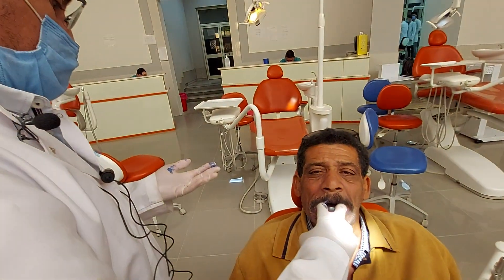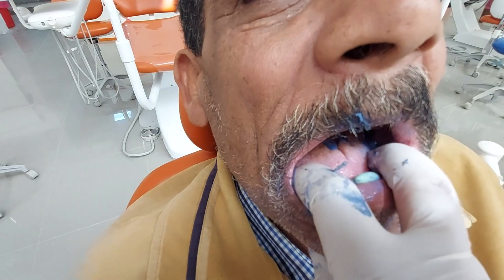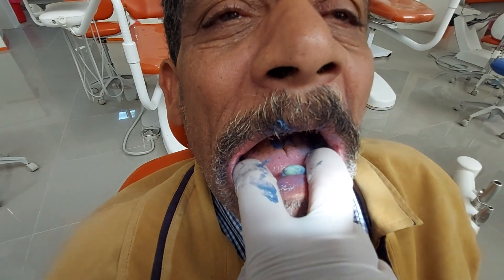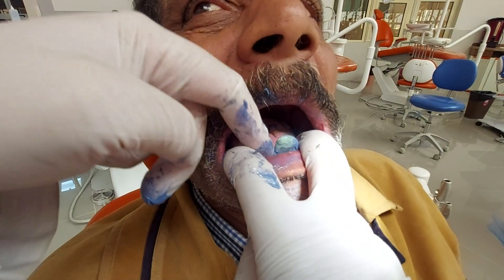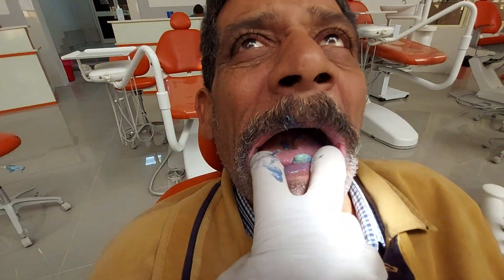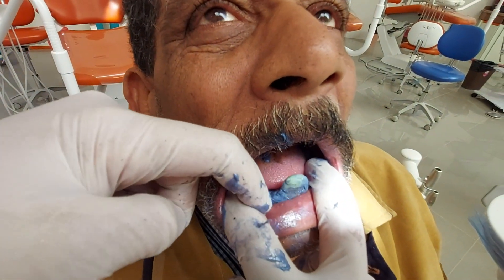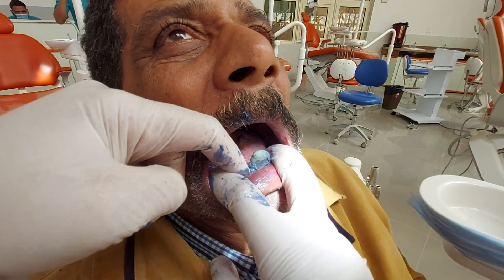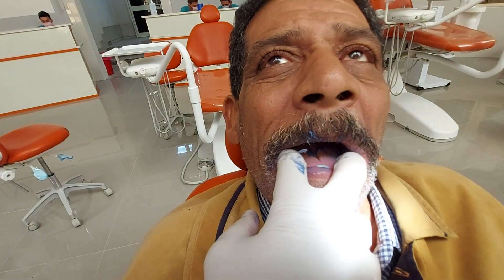Take your time while waiting for the material — never remove your hand; keep holding the tray inside the patient's mouth, otherwise it may move from its place and result in a wrong impression. Every now and then you can check the material. The material is still soft; don't remove it. As you see, I touch the material and it takes my fingerprint — I have to wait until it goes to the rubbery stage before removing it.